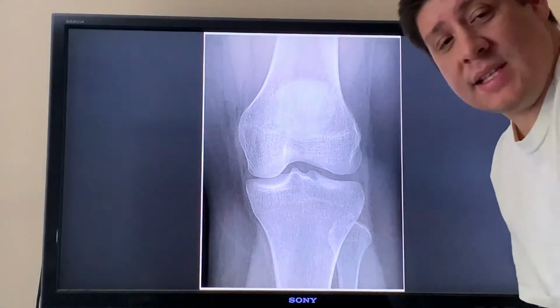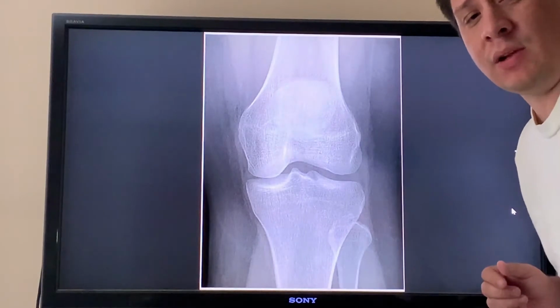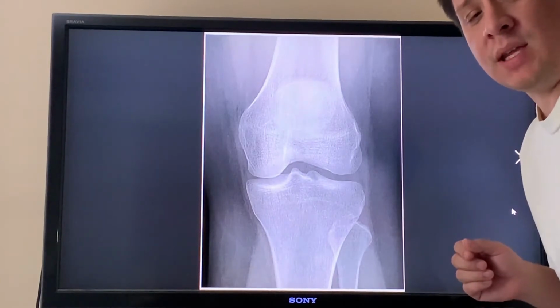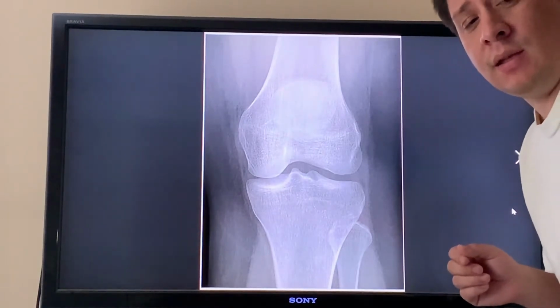Hello there. This is Alejandro Gomez performing his 102 criteria for the knee trigger. We're going to be looking through the AP projections of the knee, as well as the AP oblique with medial rotation and the medial lateral projection of the knee.